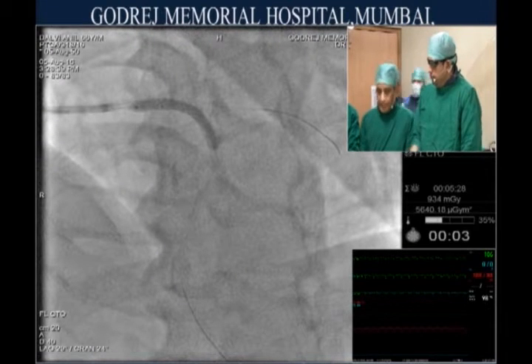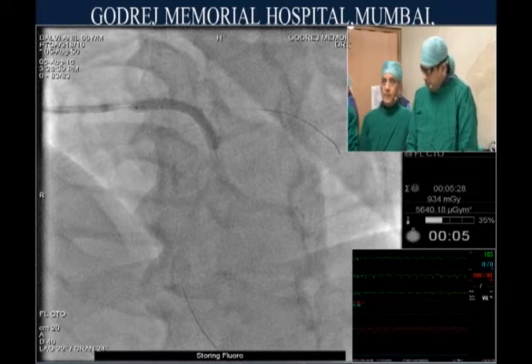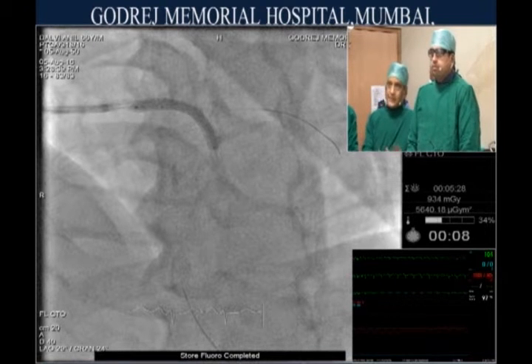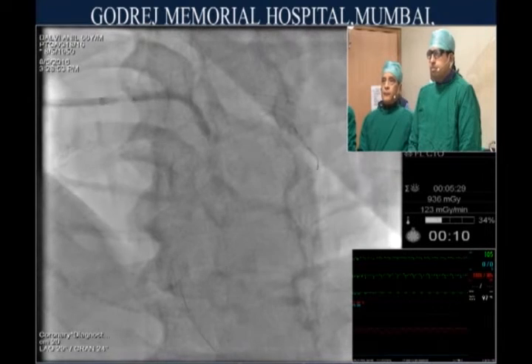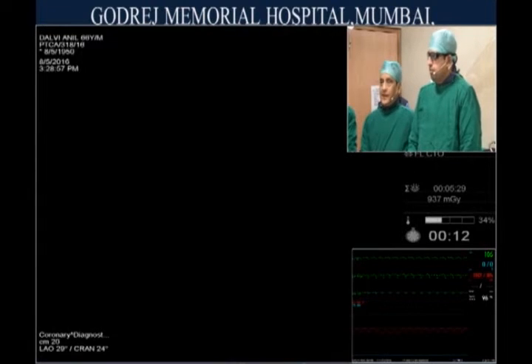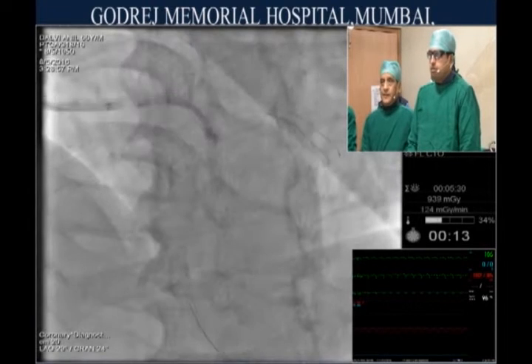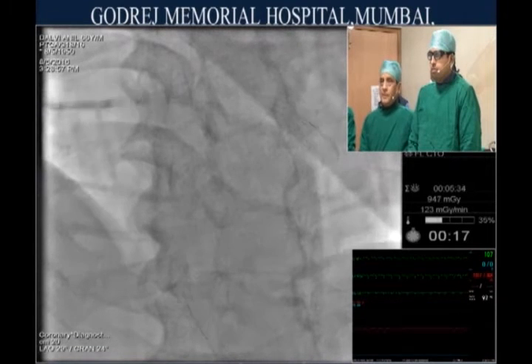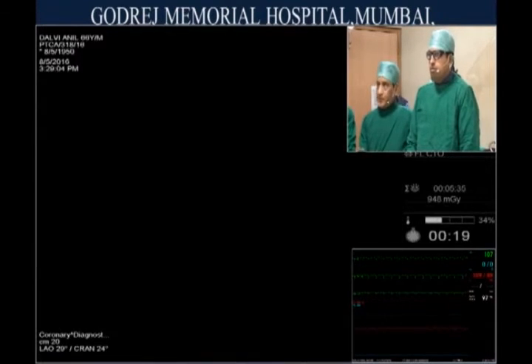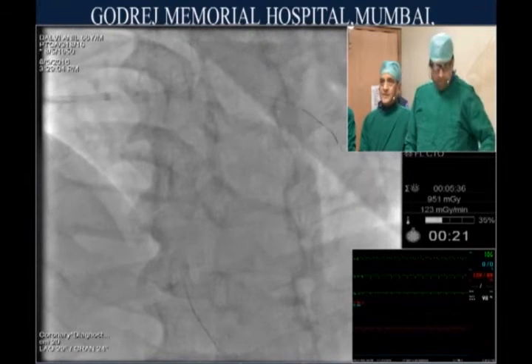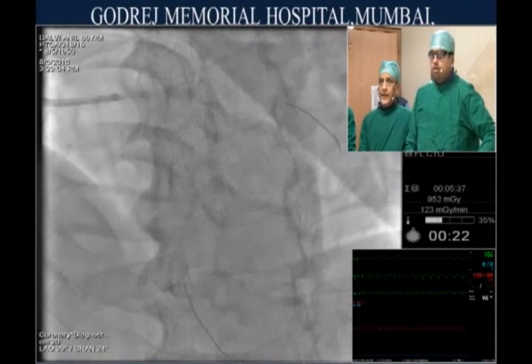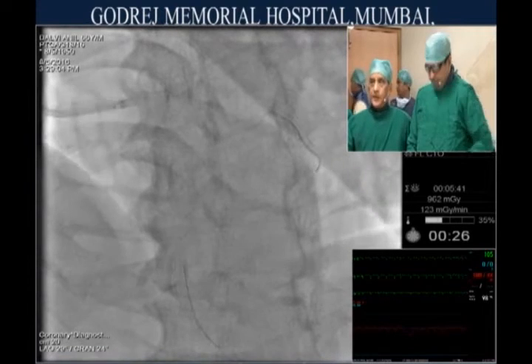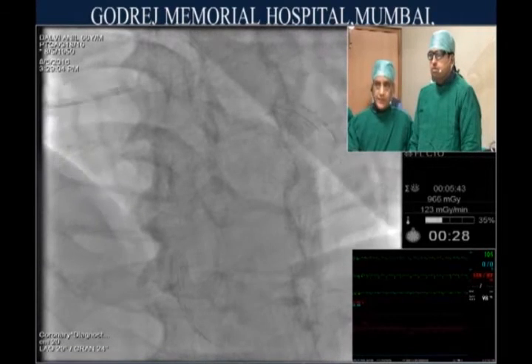In cases like this in the past, we used to put in a balloon pump or Impella. However, this patient responded to medical therapy, became stabilized, saturation was 98 percent, so we went ahead without mechanical support — although we had a balloon pump ready in the room in case it was needed.